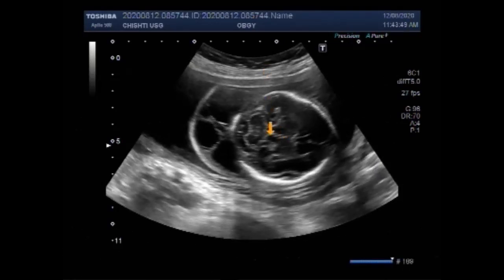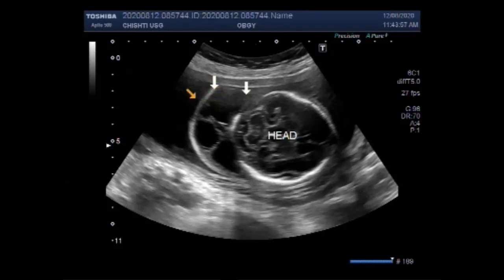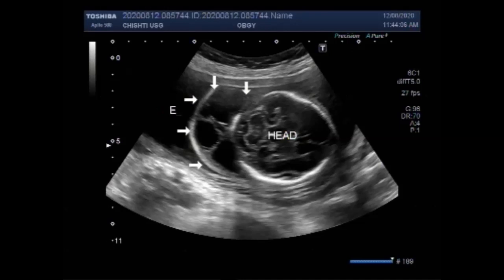You can see the fetal head. The duration of pregnancy is about 23 weeks. You can see an encephalocele — this is the encephalocele.